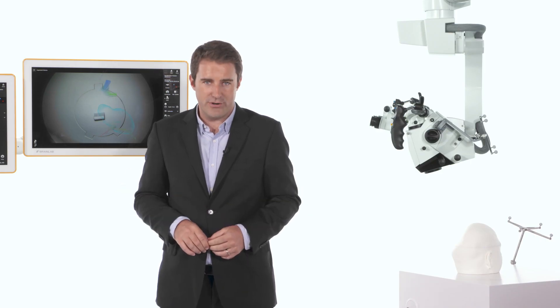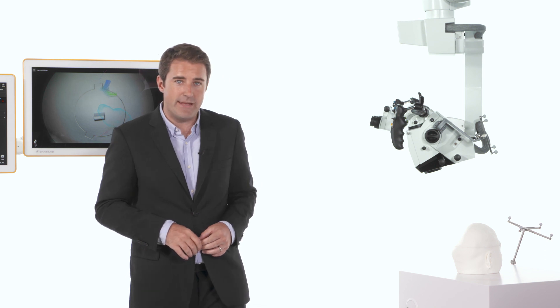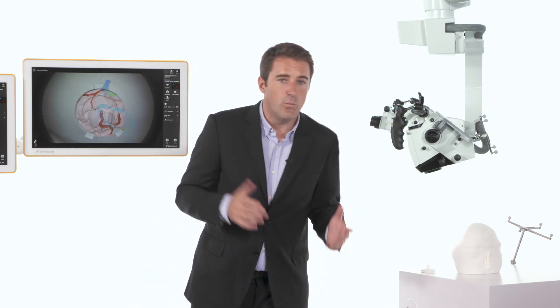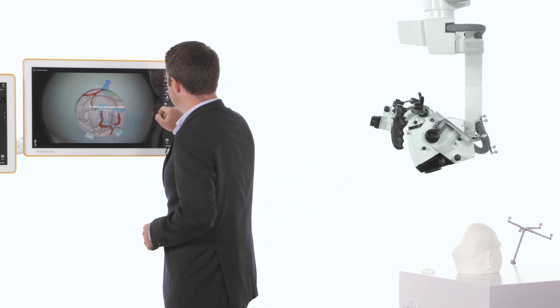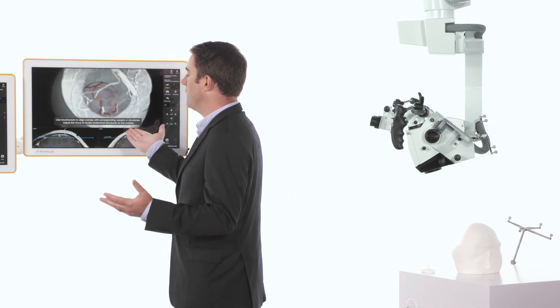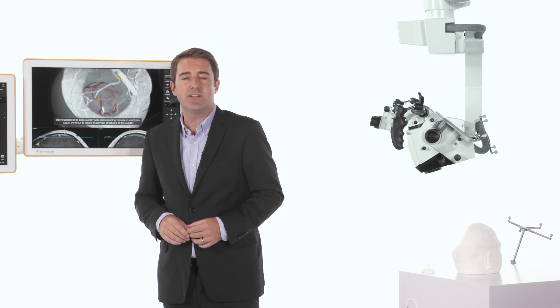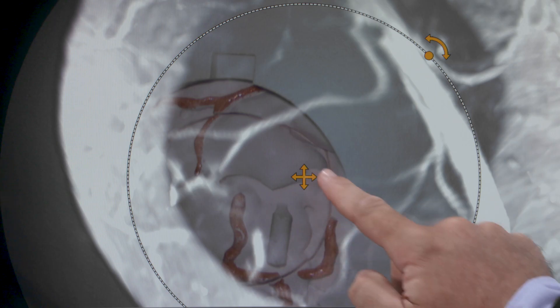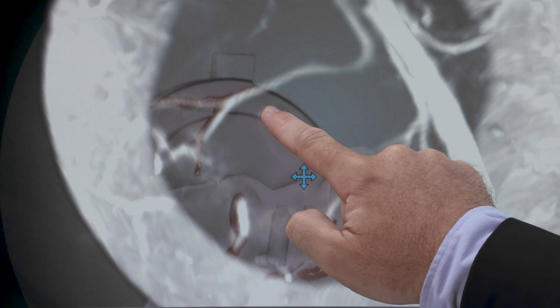Navigation shows pre-operative data. However, small shifts in anatomy may occur after craniotomy. With navigation update, vessels on the cortex can be compared with their corresponding MIP displayed on the navigation screen, enabling the surgeon to identify the shift. The MIP is then repositioned to match the vessel's scene, which subsequently updates the navigation registration.